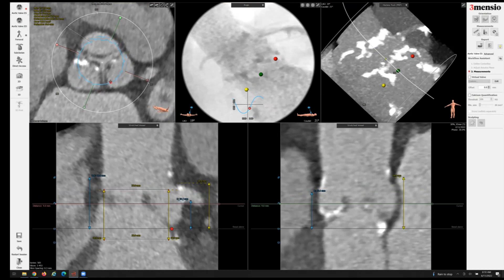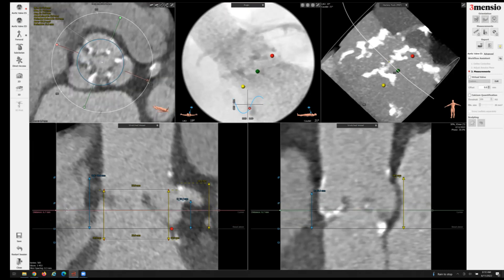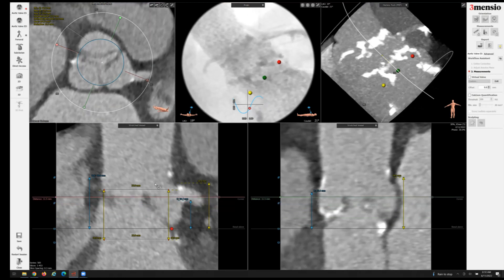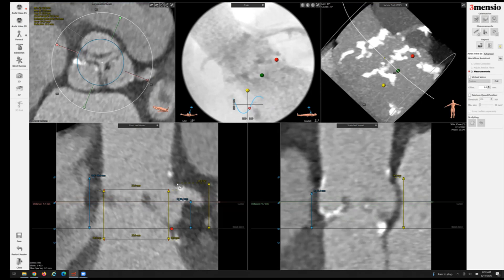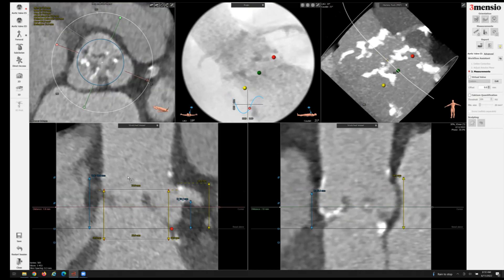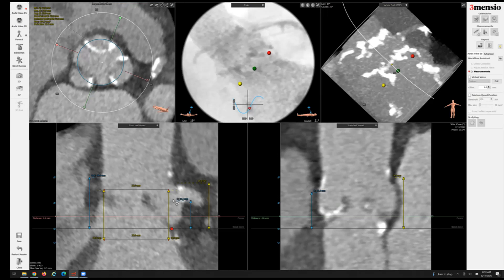You can also consider using a self-expanding valve, given this anatomy, to potentially avoid coronary obstruction. For example, the Evolute platform has a waist of 23 millimeters, so that might mitigate the risk of encroaching on the left main orifice. Other self-expanding valves also have a low-profile waist, and you might be able to avoid coronary obstruction. But if you're going to use a balloon-expandable valve, you definitely want to potentially wire the left main just in case.